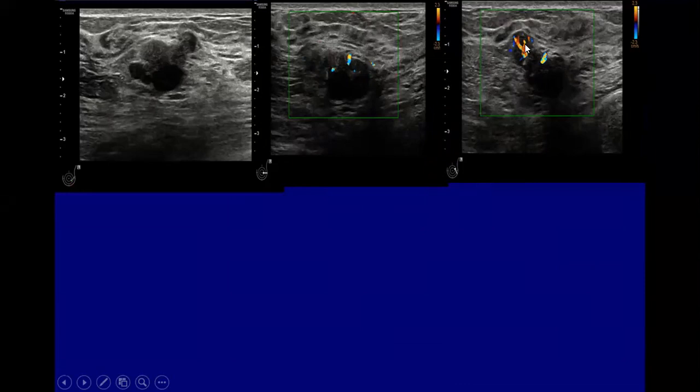So we are dealing with a vascular malignancy. Is it malignant? Are you sure it is malignant? We can say suspicious. Yes, great. But in the cystic part, I could not see any vascularity at least. That means it is probably still a complex lesion.